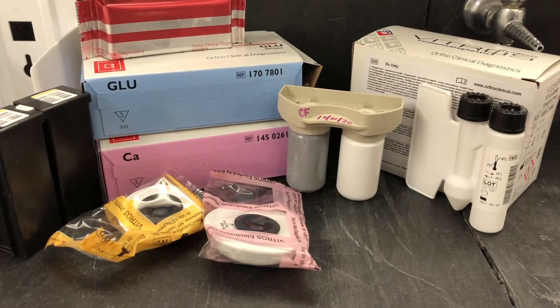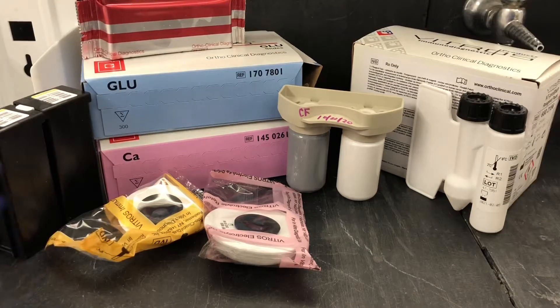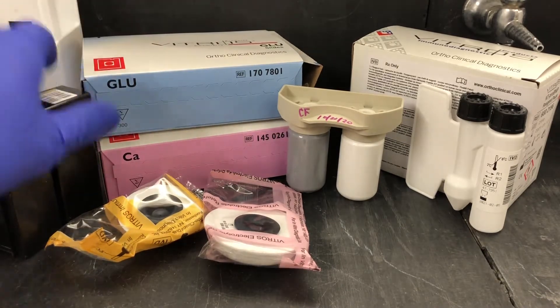In this video, I'm going to give a brief overview of all the reagents that are used in the vitros analyzer. There's quite a few, and there's a bunch of different requirements for all of them.